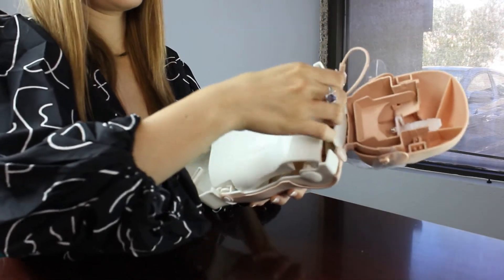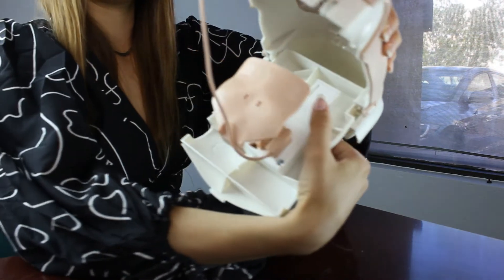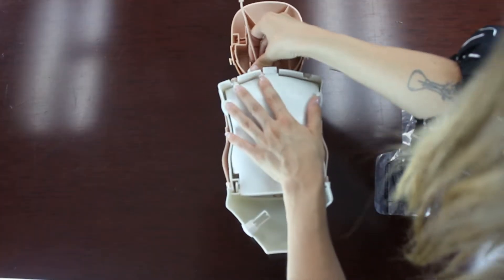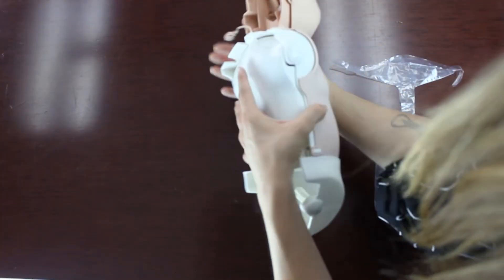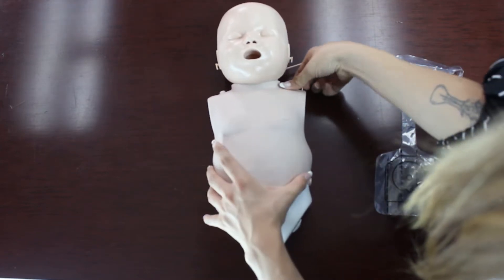Simply unlatch the back panel and rotate it down to install two AA batteries. Rotate the LED sensor outside of the mannequin, close the back panel, and unlatch the skin tabs located on each shoulder as well as the sides.